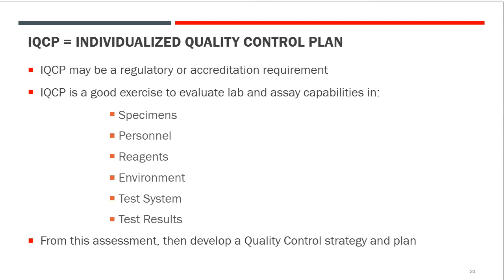From this assessment, you can then go on to develop a quality control strategy and plan. But these have to be answered, for the most part, not generically, because you need to funnel this down into what's going on in your lab, from your analysis of your laboratory needs and your laboratory processes and how things work there.